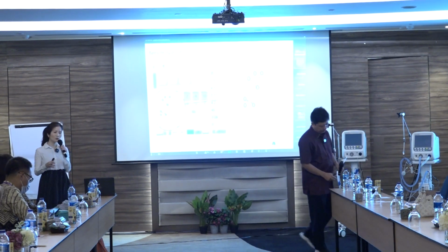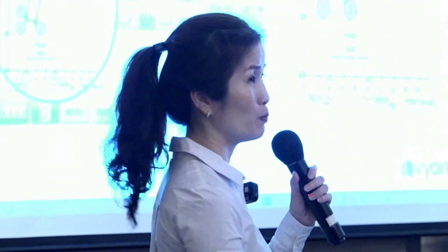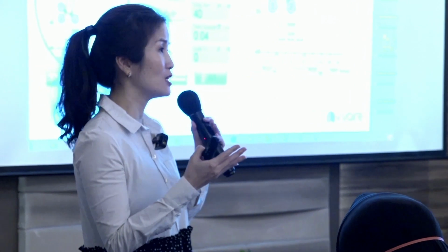For FOT, it's based on whether you want to recruit the patient's lungs. If you think the patient's lungs are de-recruited and you want to do recruitment, you can do FOT. Or alternatively, not just for recruitment itself: if you give steroids, you want to see whether the lungs improve. You give a bronchodilator, you want to see the lungs improve. Then you can also do an FOT to see whether the lung compliance has improved. There are many applications of FOT, which happens at the bedside.